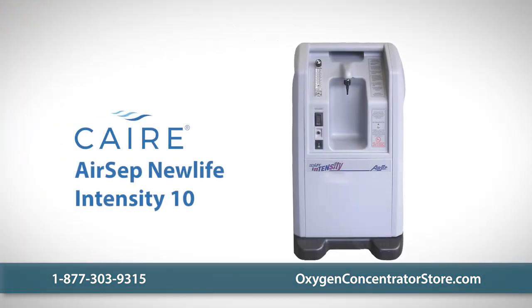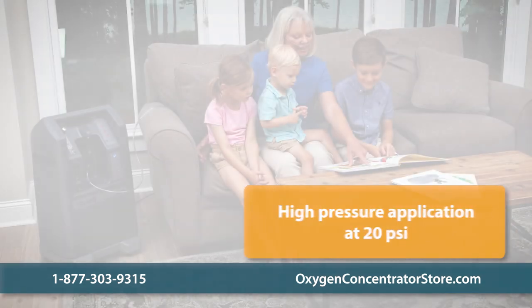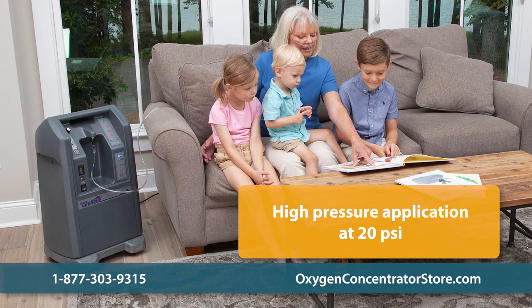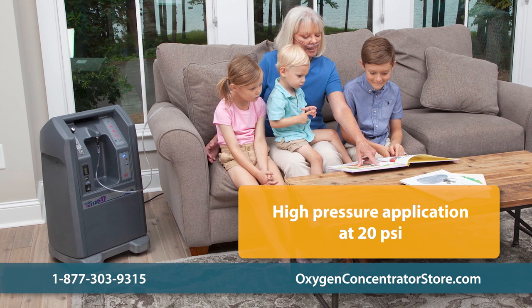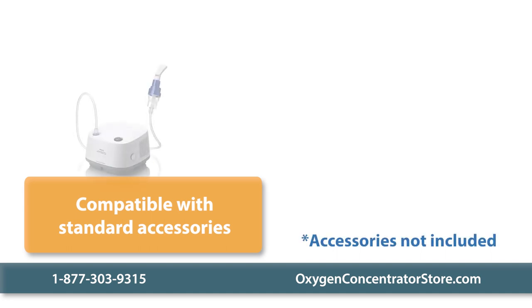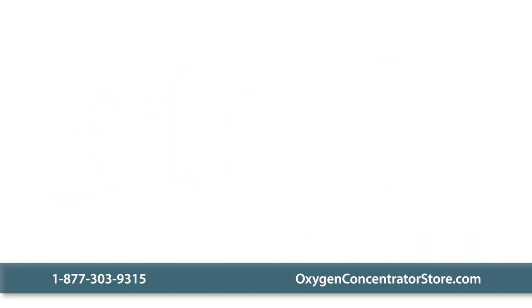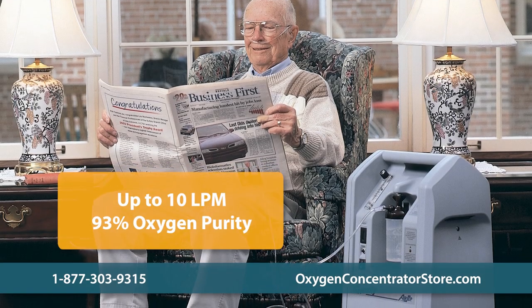The Care Air Set New Life Intensity 10 is a home oxygen concentrator with a robust range of features. The Intensity 10 operates at 20 PSI pressure — twice as much as most other concentrators on the market. It's also compatible with nebulizers, Venturi masks, and volume jet nebulizers, and can deliver up to 10 liters per minute of continuous flow oxygen.